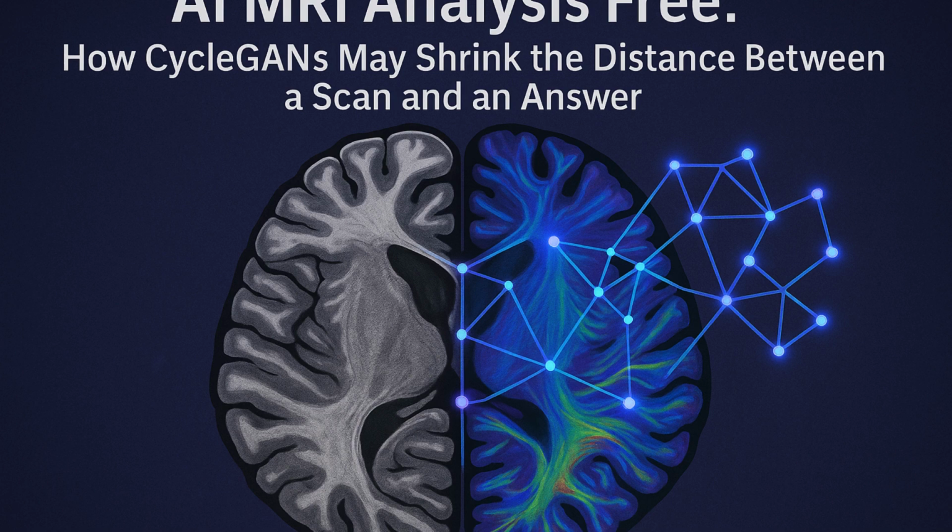If not, do they at least provide detailed metrics, like a confusion matrix? What does that show? It breaks down the errors. Shows you not just how many mistakes it made, but what kind of mistakes. False positives, false negatives. Much more informative than a single accuracy number. So if those details are missing, be wary of the headline claim. Very wary. This brings up a broader point, almost philosophical, this whole push for free insight.